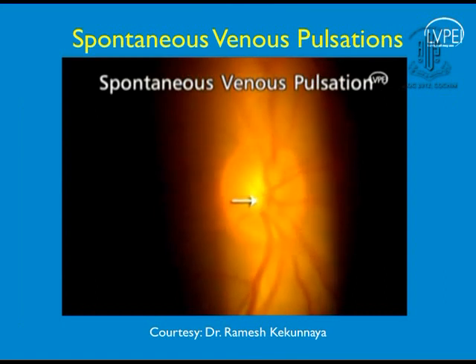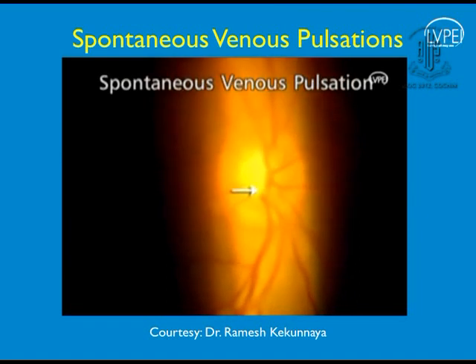This video shows you normal spontaneous venous pulsations. These are seen in the majority of normal individuals.